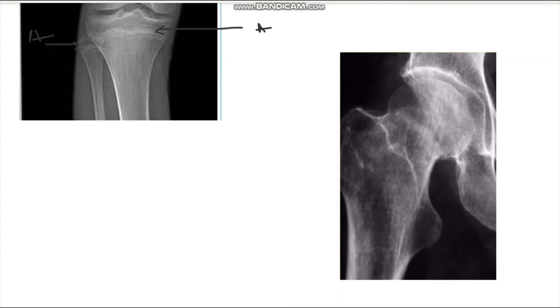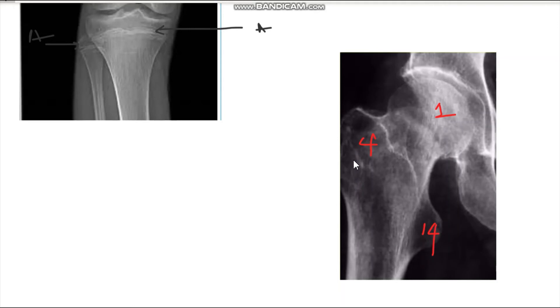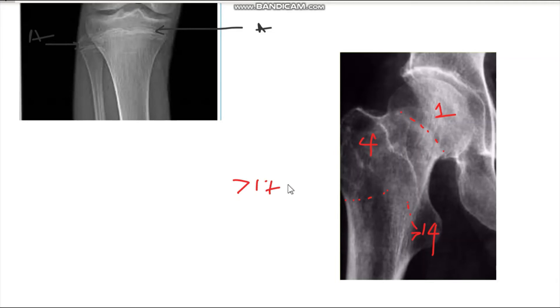Example two: this is an X-ray of the hip joint. We can see the head of the femur and both trochanters, meaning all of them have appeared. The head appears at one year, the greater trochanter at four, and the lesser trochanter at 14 — so this person is definitely more than 14 years of age. There is no gap between the shaft and the epiphyses, so they've already fused. This person is more than 17 years of age.